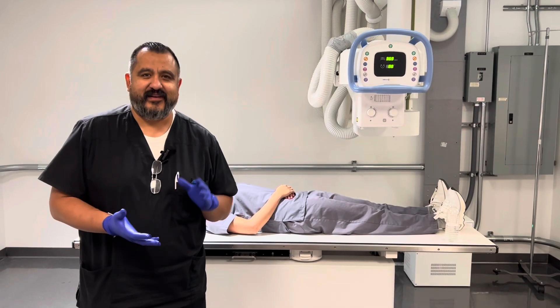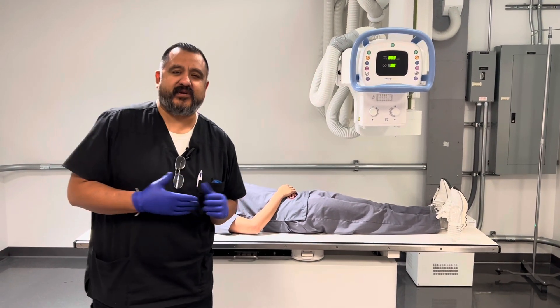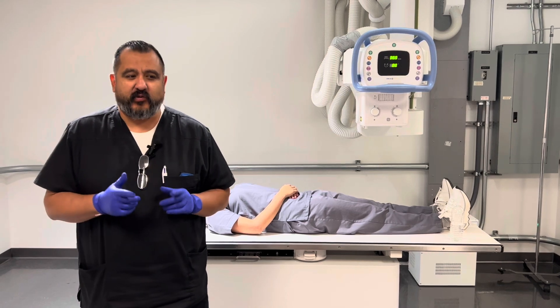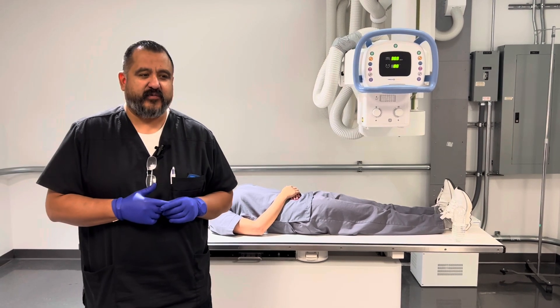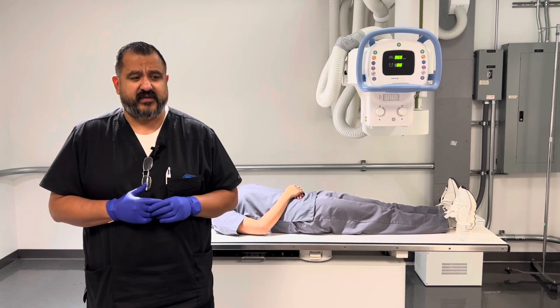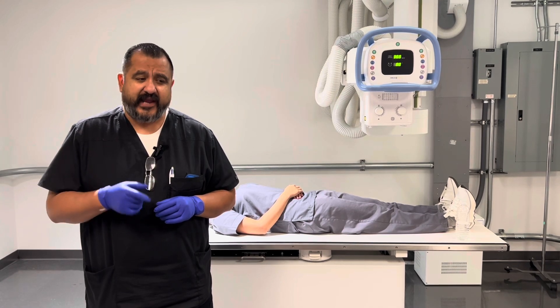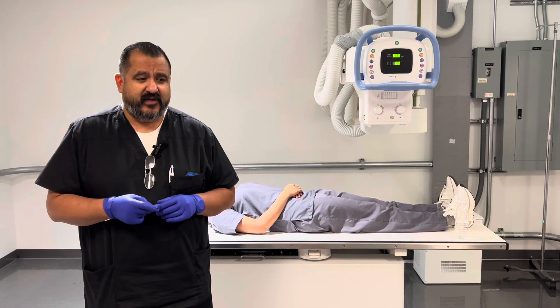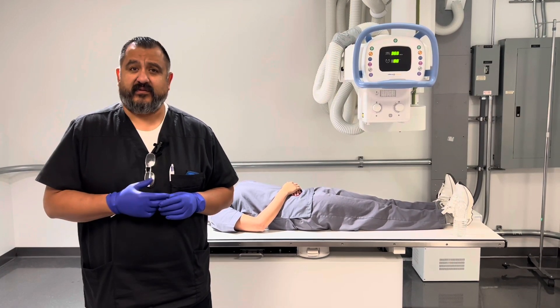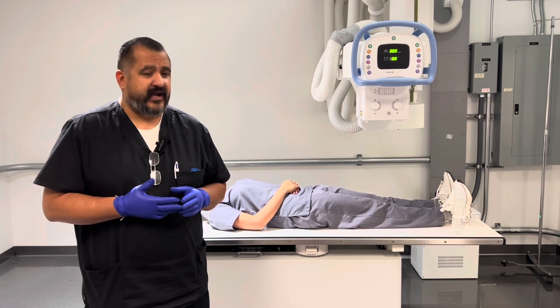Okay, today we're going to be doing lower GI positions for lower GI exams. We'll do the PA, the PA axial, the RAO, LAO, and then a left lateral.